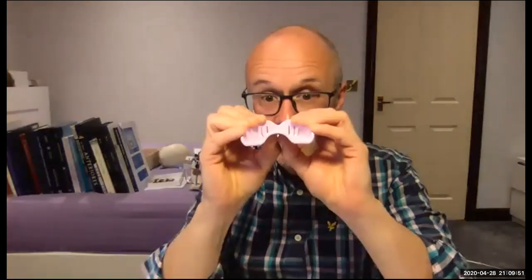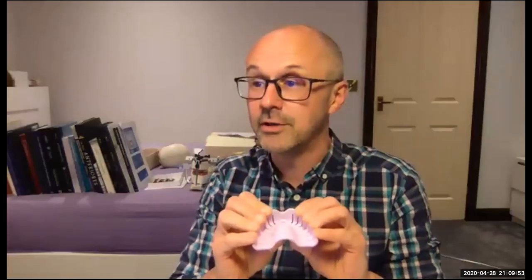Timesh Karsan, could you summarize the method of removing the primary impression from the mouth? Yeah, just really carefully. So if we're talking about a lower, it's just down the long axes of the teeth, getting my fingers around the border of the tray and just wiggling it down those long axes, and then it just comes with that. And just talking to the patient.